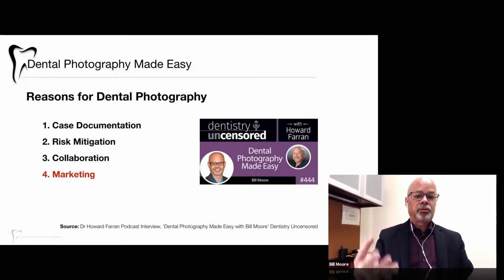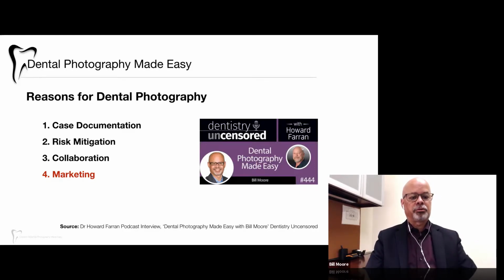And he said the top 4 reasons that he implemented dental photography in his practice were the 4 that you see here. First, documenting cases, and as Dr. Wilson said, risk mitigation. So in case you got sued by a patient, that never happens, right? You have proof of what you did, why you did it, and all that kind of stuff. So that's important. Dr. Wilson mentioned collaborating with other doctors and specialists. Even your lab, it's a great way to improve communication in a lot of different ways.